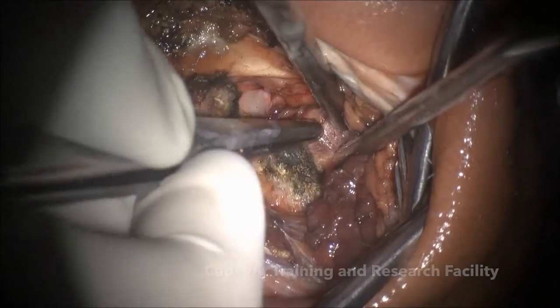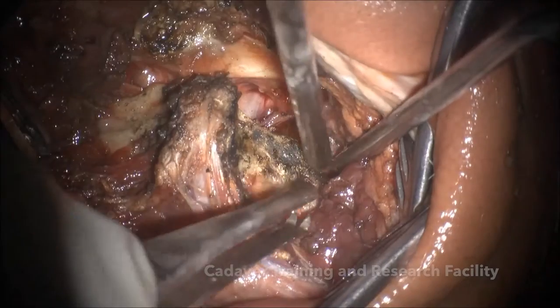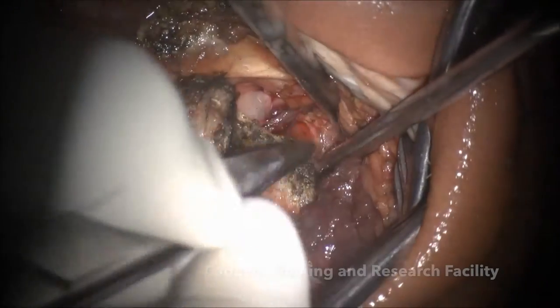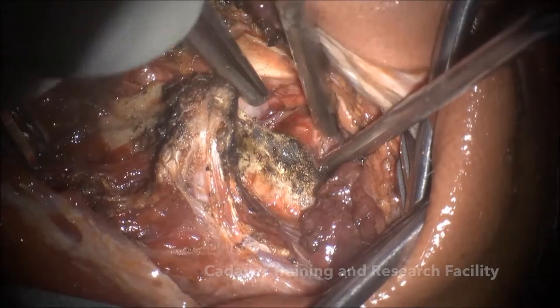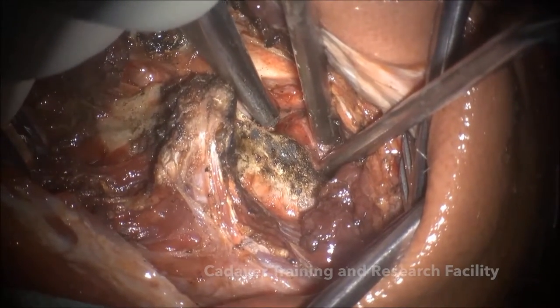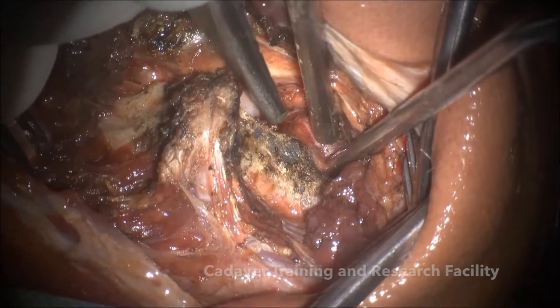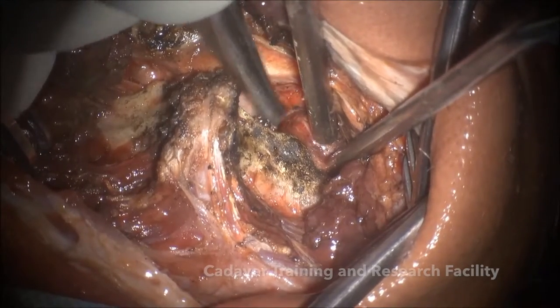You have to understand there is bleeding only from three points here — there is no bleeding from the fourth point. There are only three points which are bleeding. The fourth point of bleeding is epidural, so when we are cauterizing here and these epidural veins are retracting inside, you will have bleeding from inside.